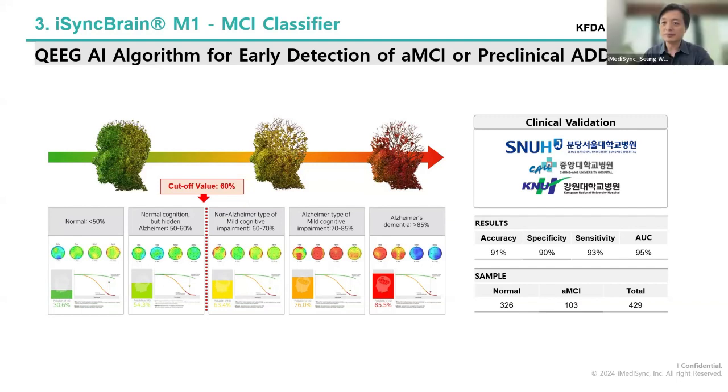If we could see what this AI made from the QEEG data, that difference or border, we could show the patients the data and explain to the patient about the AI prediction. I guess that's the point of our problem or question.